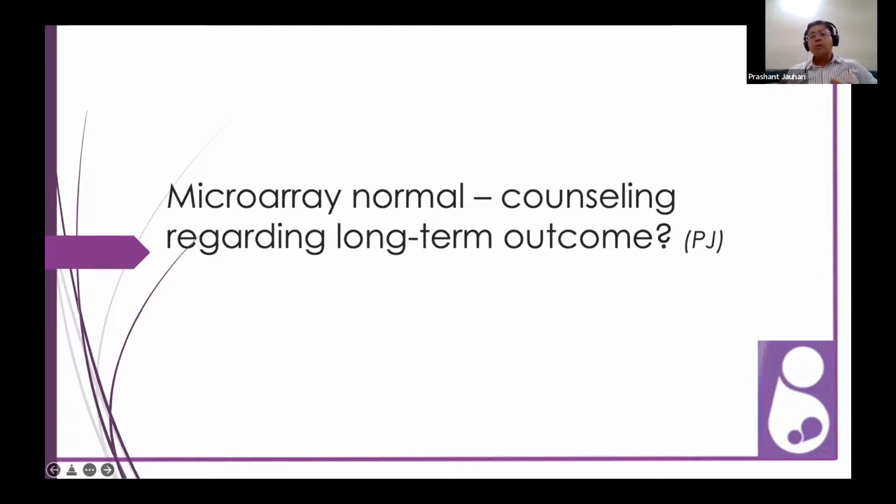So how we can be more certain, more truthful is that first, if you start from very early, see what was the timing at which whatever scan was done and has been sent to you. If it is quite early, and if you don't see your mid-sagittal and coronal images, and they are not very clean and clear that you can yourself say, yes, it is an isolated ACC, repeat it maybe yourself and see whether it is actually an isolation or not.